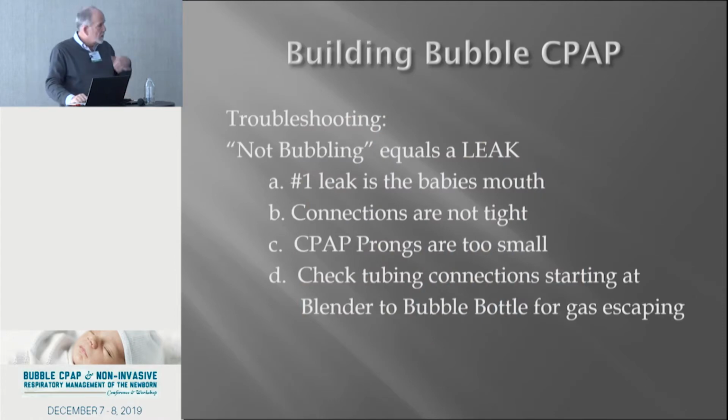Troubleshooting. As I said, I tend to start from the wall and work to the baby. That's probably not the best, but that's just the way it is generally, because a lot of people, maybe that's to counteract the fact that the baby's not doing well. I don't know why you don't look at the baby, but they're looking at my machine, so I want to make sure that what I'm doing is working, okay?